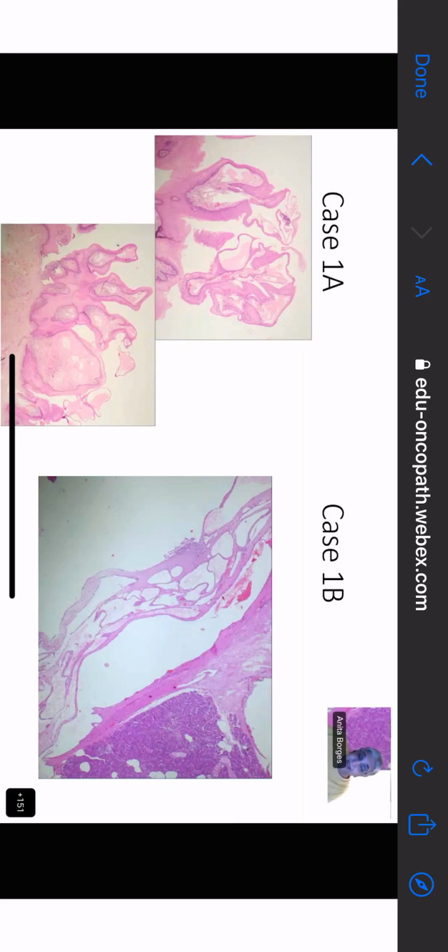It means that there is a proliferation of an epithelium above the surface, into a lumen, or whichever way you want to describe it, but that it drags along with it its fibrovascular core. So it is essentially a proliferation of that epithelium, and there is no other pathology that is associated with it.